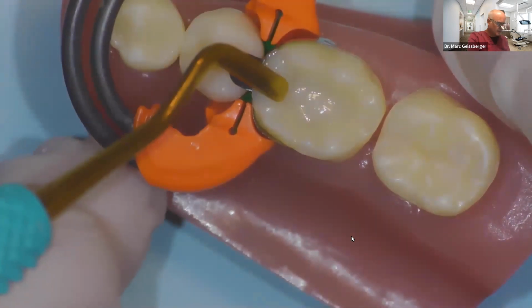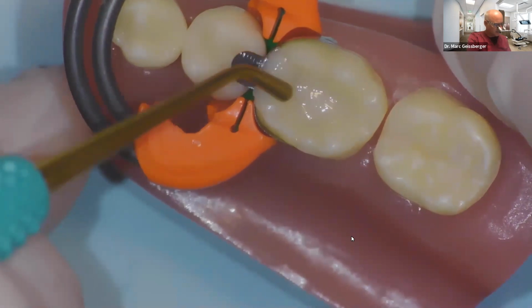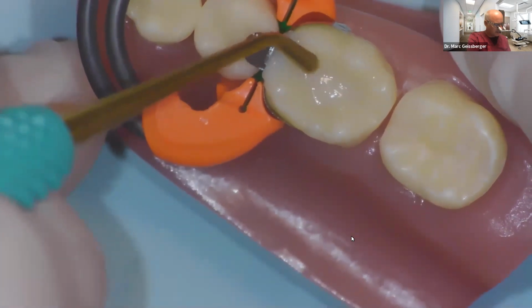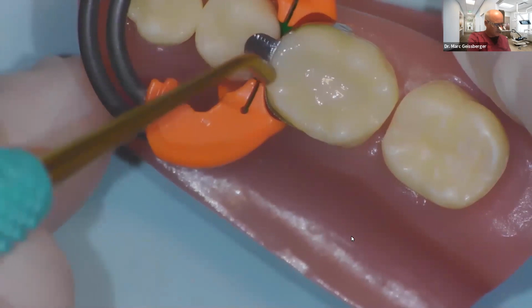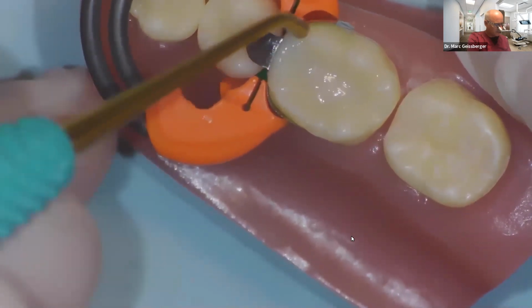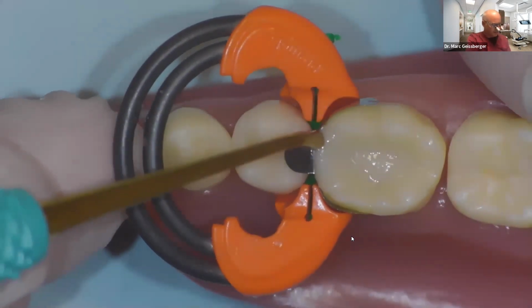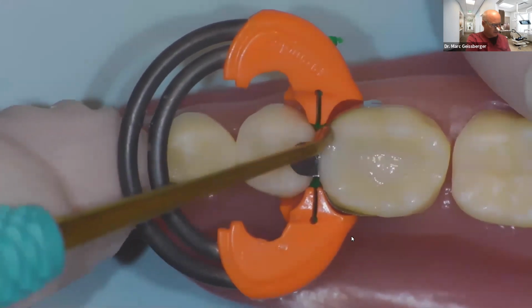Now what I'll do is I'll lay this on its side and just condense that just a bit. I'll thin out my marginal ridge by using the instrument and pulling some of that composite down to give me that correct marginal ridge height. So I'm just beveling, forcing that material into my bevels. And now I've got my marginal ridge placed to the height. If I notice anything, again, I'll bevel out to where I want the material.